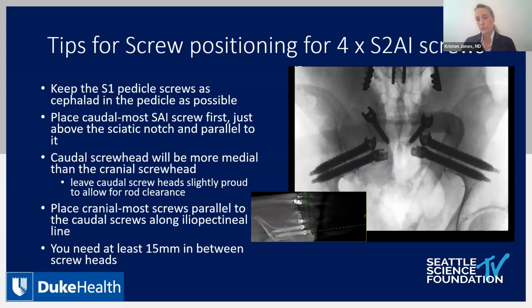Of course, you don't have to use dual headed pedicle screws. You can just easily use an offset connector as well. But I think we really need to do a study to understand if there is a biomechanical advantage to a dual headed pedicle screw versus an offset connector as far as the strain itself. But I don't know the answer to that. That's just my own preference, is not to use connectors whenever possible.